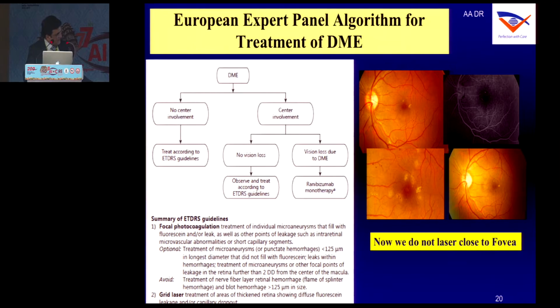I alluded before this that if you have a central involving diabetic macular edema, we don't go ahead, and this is the laser which I had done way back in 2004. You can see how close to the fovea we used to go when we didn't have anti-VEGFs available. These patients used to do well.